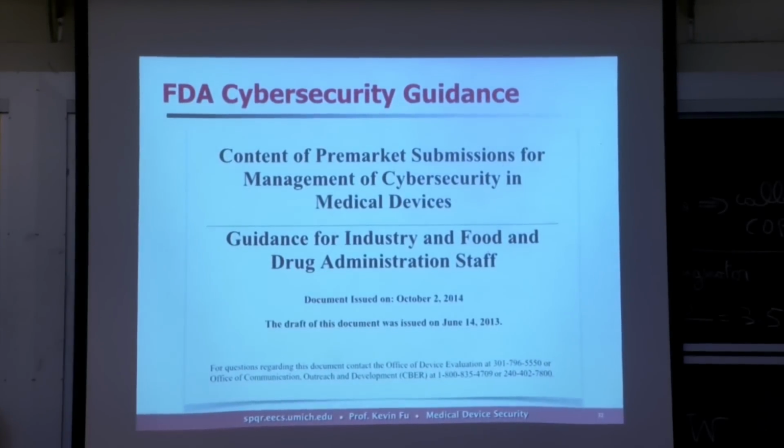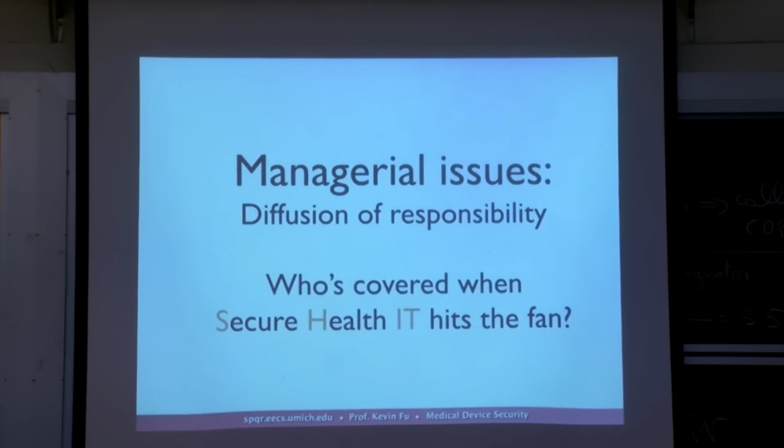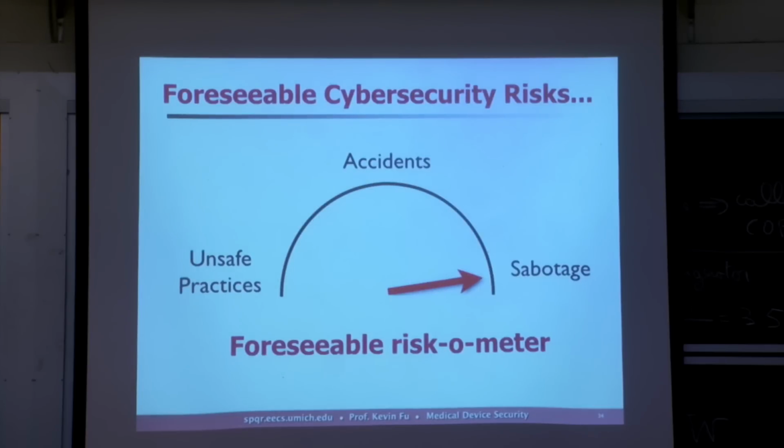So the Food and Drug Administration has now released some guidance, actually just a month ago, on what they expect to see from manufacturers in terms of how they think of it as a design project. As you're writing down all the requirements of your medical device, they're asking manufacturers, how have they thought through the security problems and all the security risks? How are they mitigating them? What risks are they accepting as what they call residual risk, things that they don't solve? But they expect them to at least be aware of all the risks and ideally mitigate them. So with the management of software, when no one person is accountable, all sorts of crazy things happen. But there is some guidance now beginning to emerge to help the manufacturing community better integrate security into their products.